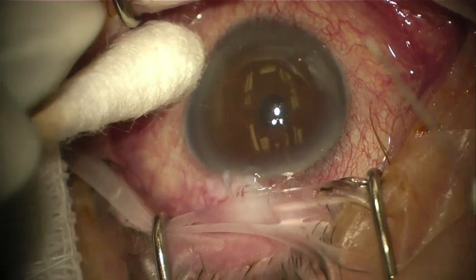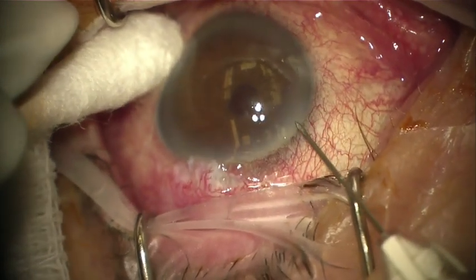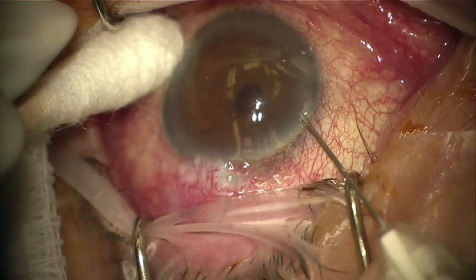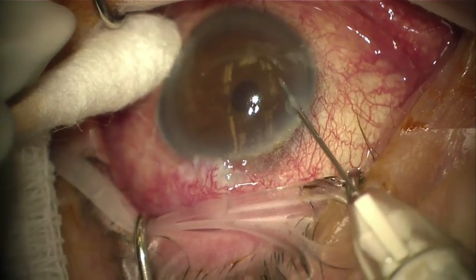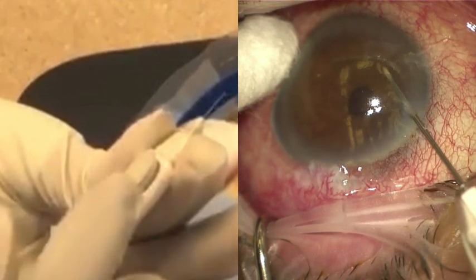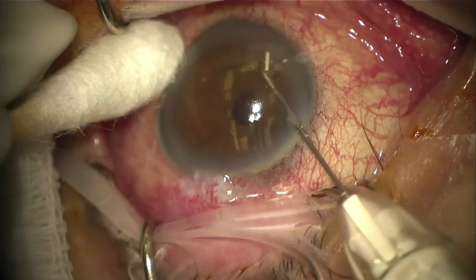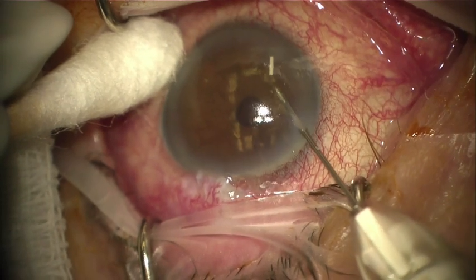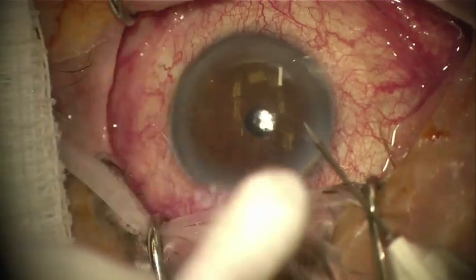Using a cotton tipped applicator for stabilization, I take the injector and aim the tip nasally at the limbus. Through clear cornea, the injector is aimed inferiorly. I depress the button on the injector firmly. I like to use my index finger to depress on the back edge of the button. The Durista implant is released into the inferior aspect of the anterior chamber, and I pause and then slowly withdraw the injector tip.